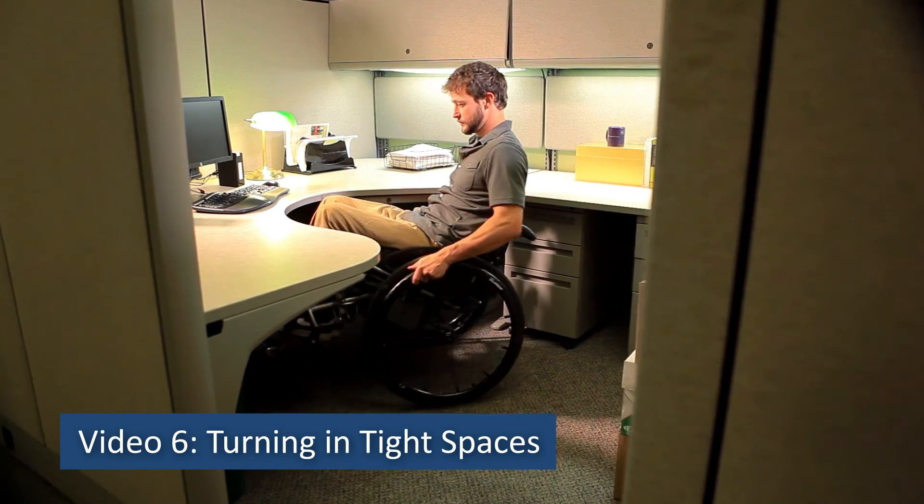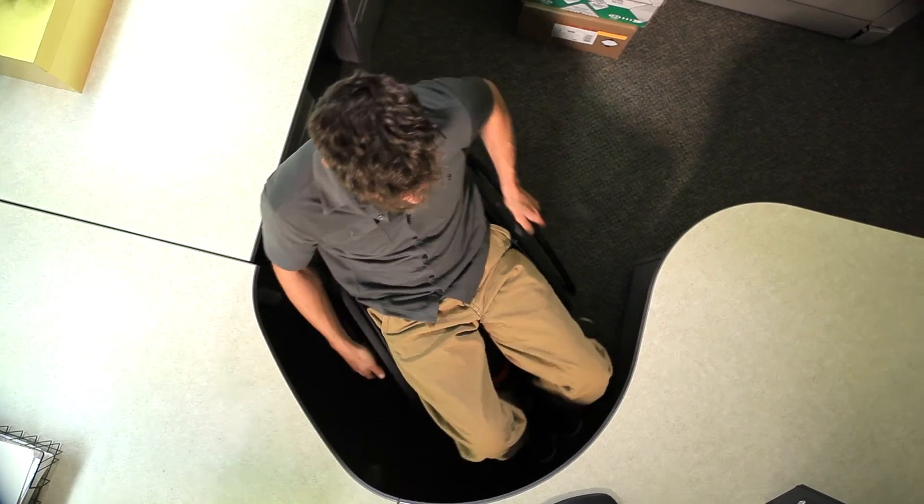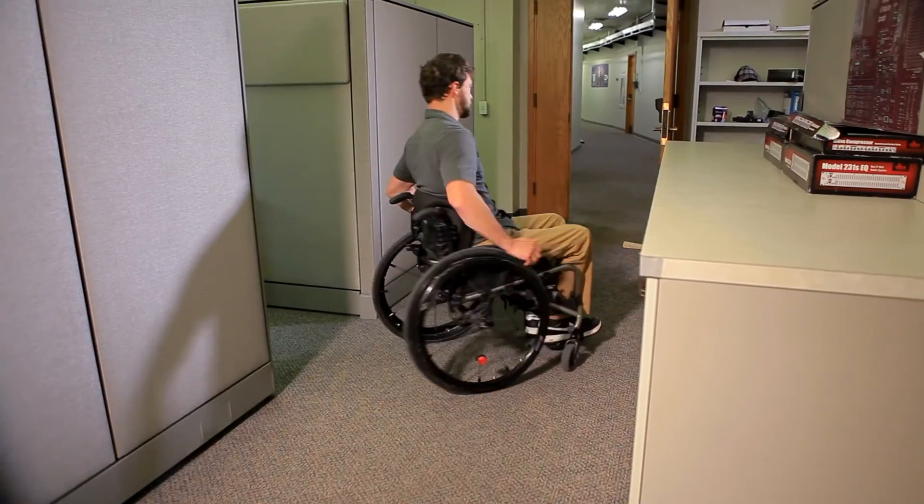Video six: turning in tight spaces. Pivoting in place in a wheelie can allow you to turn around in small spaces such as elevators and bathrooms.